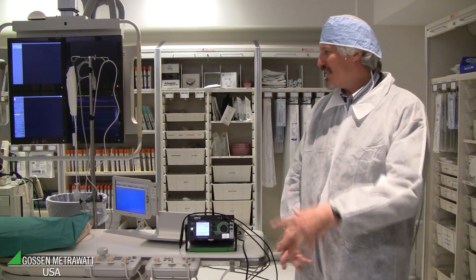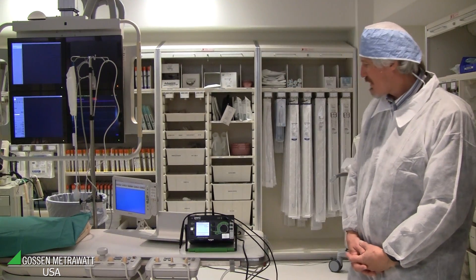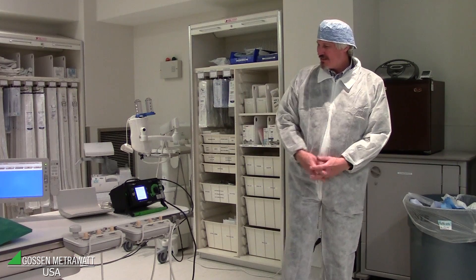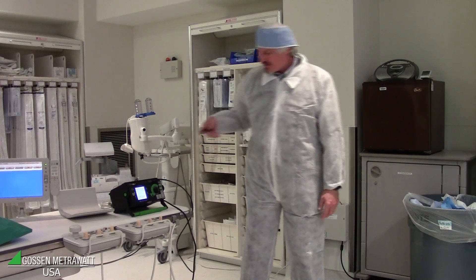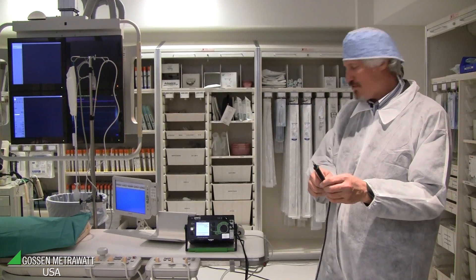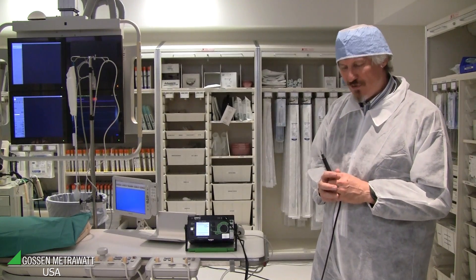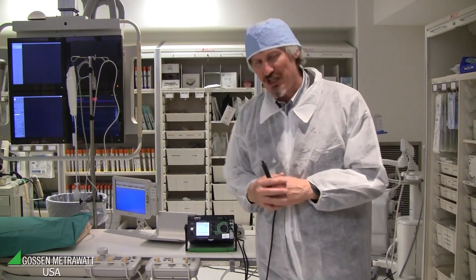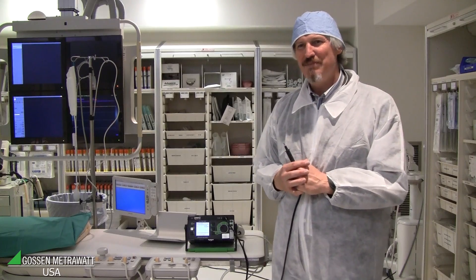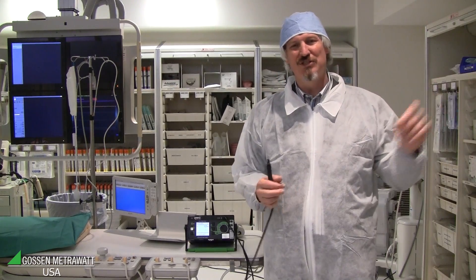In this measurement we do touch current and patient leakage current. We measure the current from each accessible part to ground. For doing this on a fixed installed device, we measure the current flowing from this probe to the ground of the system. The ground of the system is connected by a special adapter. The adapter has power supply for the instrument and ground with the system ground.